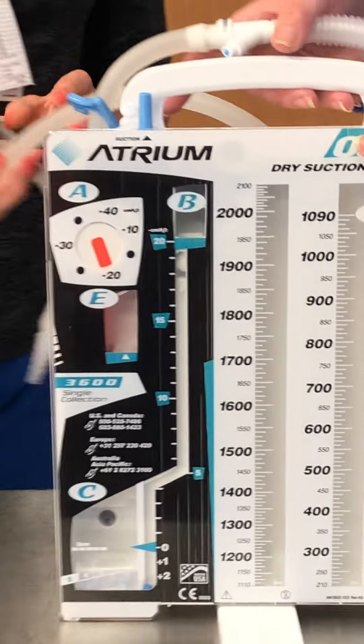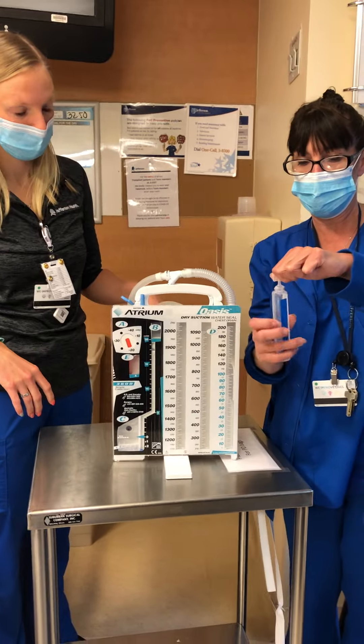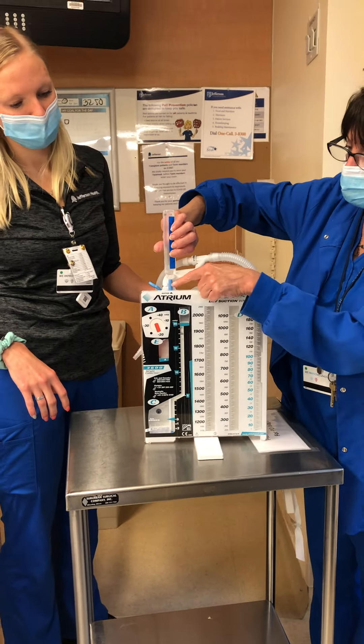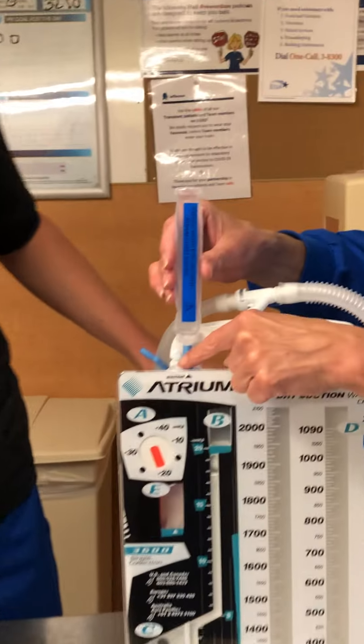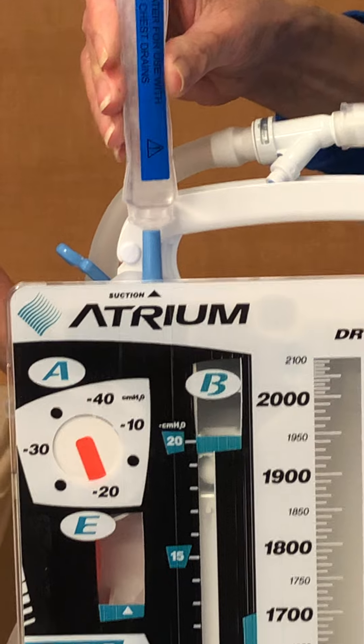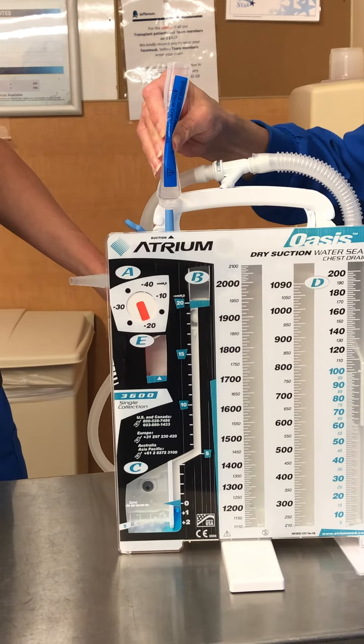To get your chest tube ready for use, you want to take the sterile water from the back of your chest tube. Twist it off. Insert it into this little blue port — this is the only port that you use at any time to manipulate the chest tube. And as you can see, it comes down here to your water seal chamber.